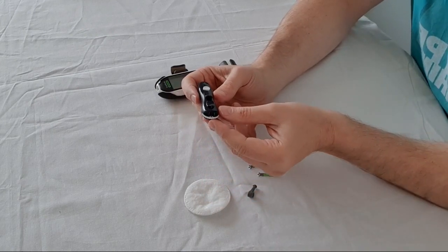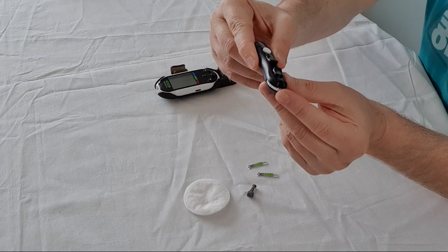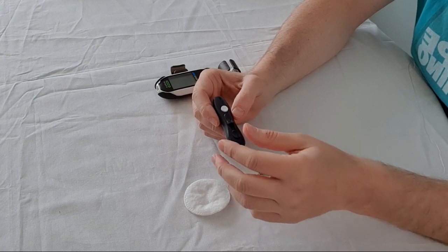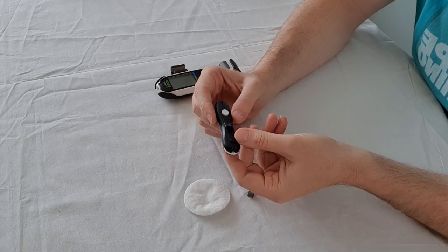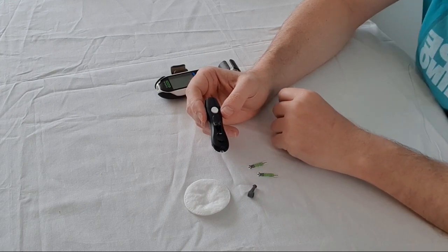At the bottom you should have a number which you can alter — this determines how far the needle pops out into your finger. I suggest you only use it deep enough so that it will actually penetrate. You don't want to use it more than once if you can avoid it, because every time you use it you make the needle blunt, and you want to avoid that as much as possible.